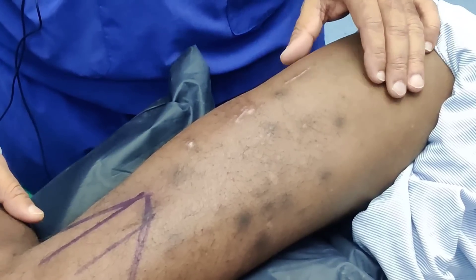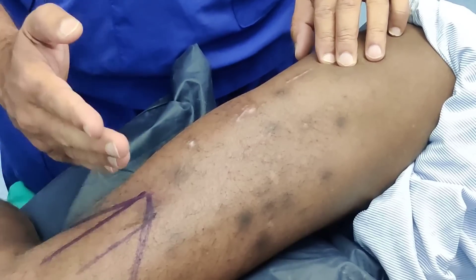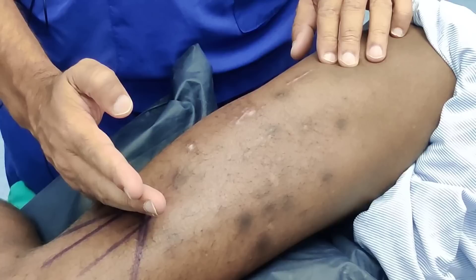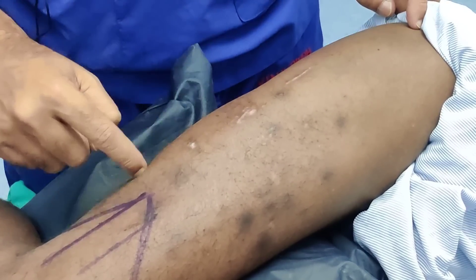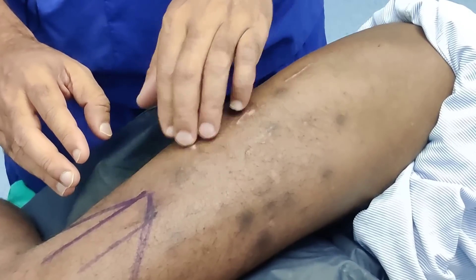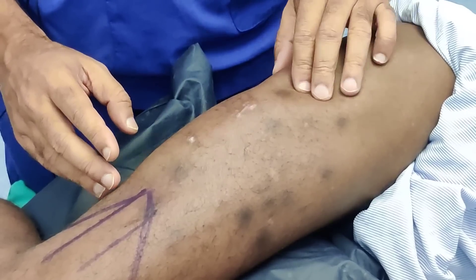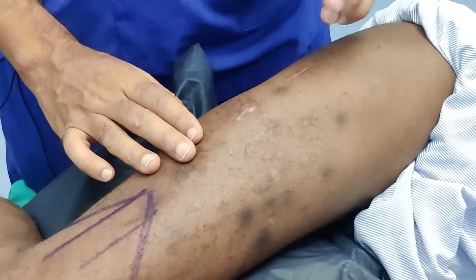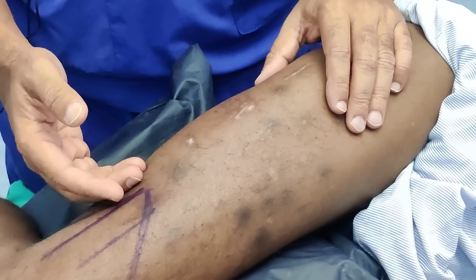This gentleman has a large collection going from the greater trochanter down to the junction of the lower one-third and upper two-thirds. This is the extent of the collection. If you palpate it, you feel a collection of water just underneath the skin — it is a serosanguinous collection. If I tap it, you can see my finger jumping — it is like water.